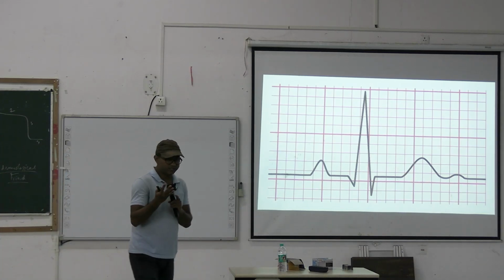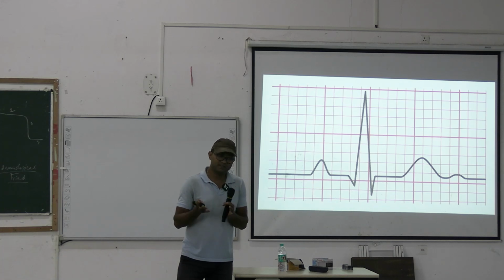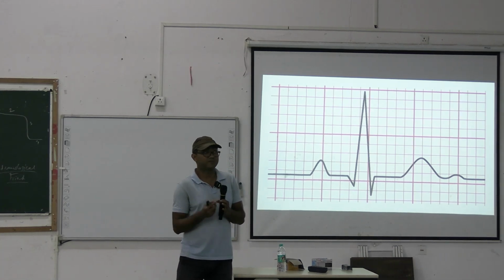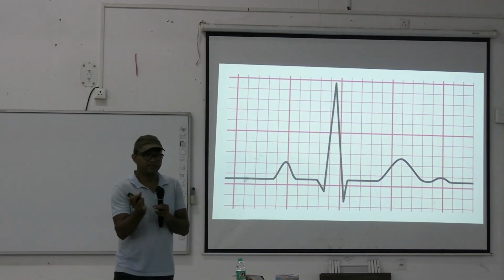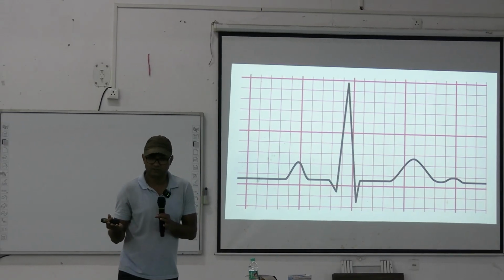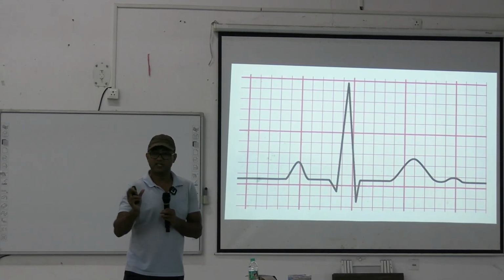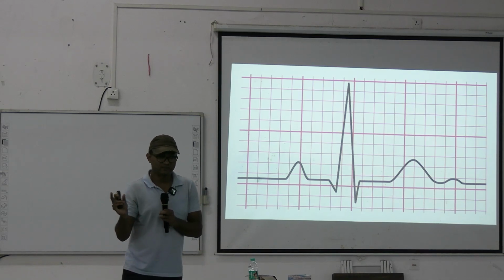Actually, in an ECG we do not need to measure it because nowadays ECGs are computerized, so your software will measure, ঠিক আছে। আমরা কতটা মাপছি, আমরা একটা স্কয়ারের পুরোটা হলে বুঝতে পারছি, একটা স্কয়ারের যদি অর্ধেকটা হয় তারও কম হয় তখন তো আমরা ক্যালকুলেট করতে পারবো না। সো কম্পিউটার ক্যান মেজার, ওকে। So 1 small square is 0.04 second, half small square is 0.02 second, okay.